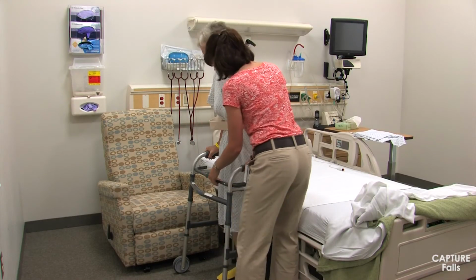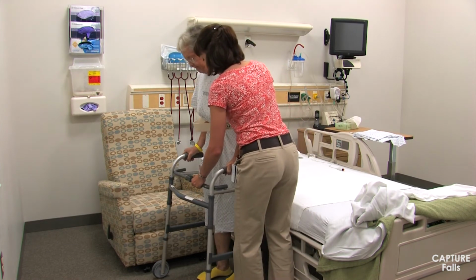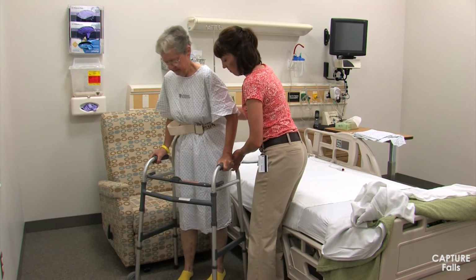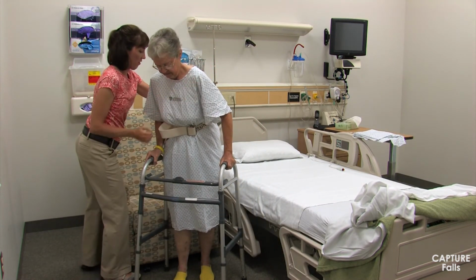You can also quickly assess how the patient is tolerating the upright position by asking her, observing her facial expressions, and feeling how steady she is. Have the patient take small steps to move her feet toward the chair. She should push through the walker as she moves her feet, as that is the function the walker serves, to take some of the weight off of the lower extremities and also assist with balance.